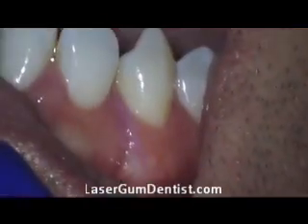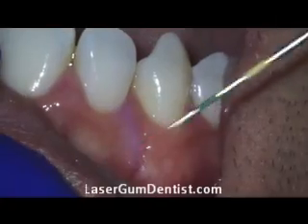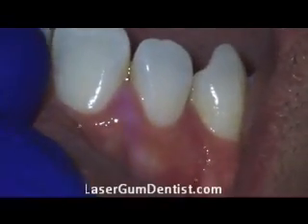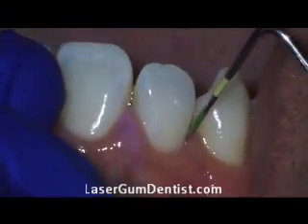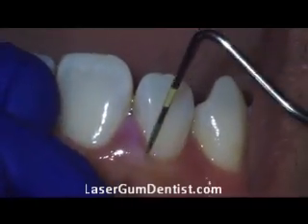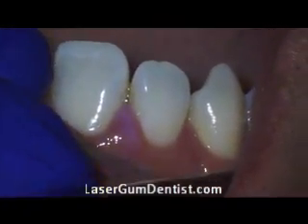Here you can see the after images. This was taken with a Global Surgical G6 microscope through a Sony NEX-5 camera. What you're seeing is the after result. The instrument is going in two to three millimeters and we no longer call this a pocket — this is now a sulcus, a very healthy after result.